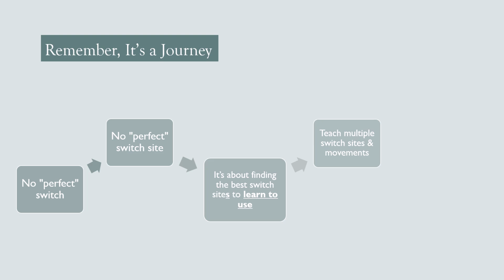Students can use multiple switches to control various devices such as toys, lights, etc., to have greater control over their environment. Also, students may fatigue when only using one site, or may have an injury where they cannot access that switch site or movement for a period of time.